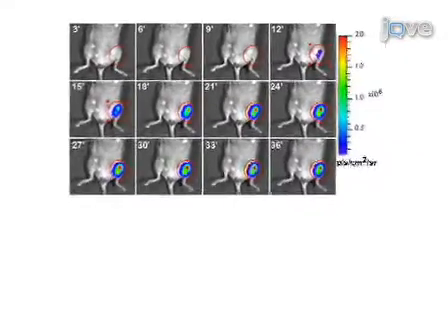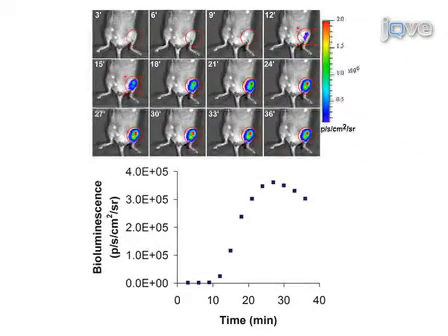During the acquisition of bioluminescence, the bioluminescence signal in the ROI will increase with time until reaching a maximum value, and then decrease. In this figure, the maximum value of bioluminescence, as measured by the maximum radiance, is obtained at 27 minutes from the start of acquisition. This maximum value should be reported for data analysis.